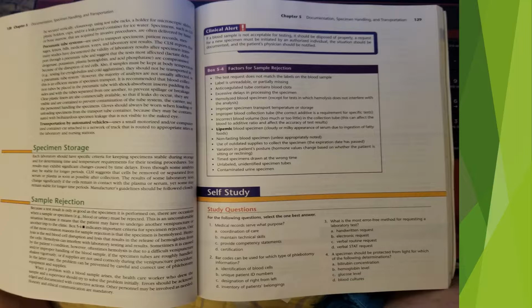It is recommended that blood collection tubes be placed in a pneumatic tube with shock absorbent inserts padding the sides, and with the tubes separated from one another to prevent spillage or breakage. Clear plastic liners are also commercially available, so that if leaks do occur, they are visible and are contained to prevent contamination of the tube system, the carrier, and the personnel handling the specimens. Gloves should always be worn when loading or unloading specimens from the transport tube container, because there may be contamination with biohazardous specimen leakage that is not visible to the naked eye.